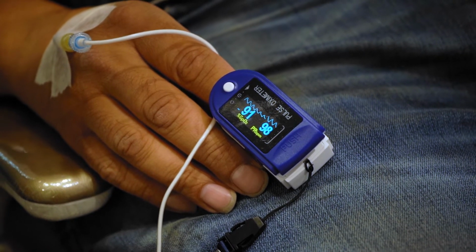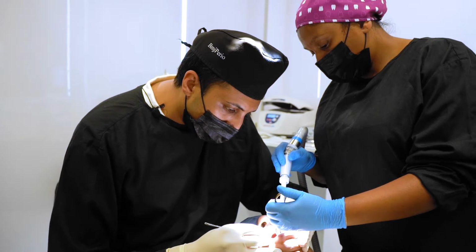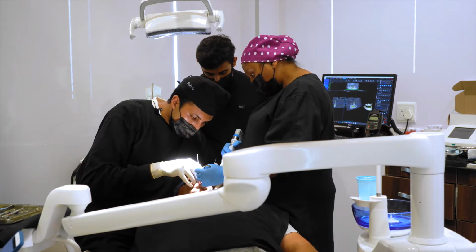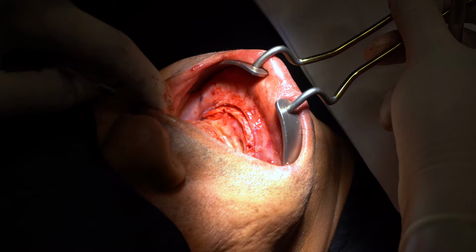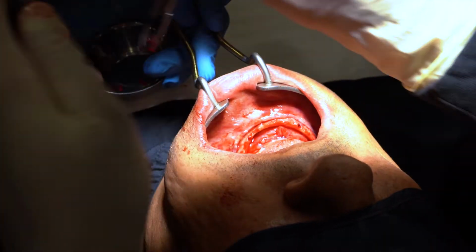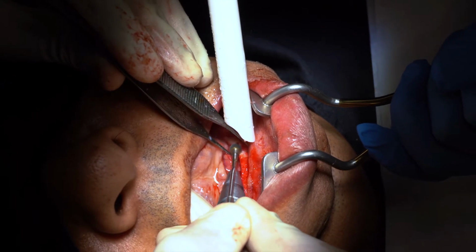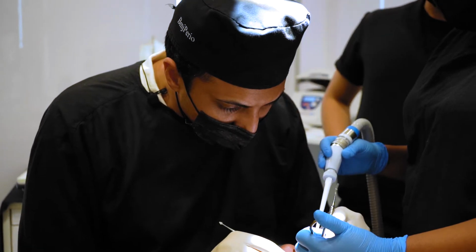Okay, we're removing the other implant now. So the longer you live without any stimulation to the bone, the more bone you lose. And an implant requires bone volume, both in vertical and horizontal dimensions. So in the lower jaw, for example, we've got the main nerve canal that supplies your lower teeth and jaw with blood supply as well as sensation. So if we lose height above that nerve, then we may not have enough to place an implant. All the implants are out now. He's only had 2 implants on the bottom jaw.